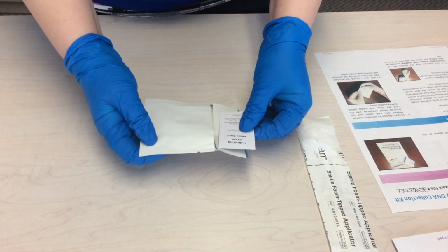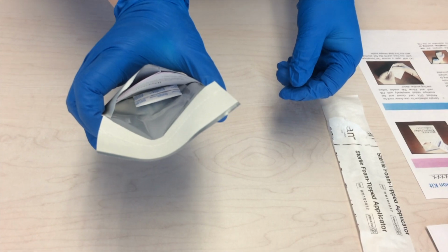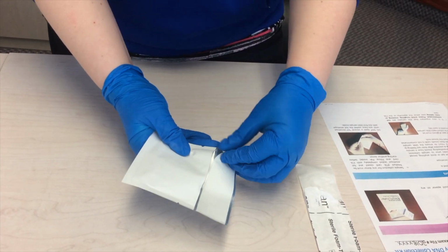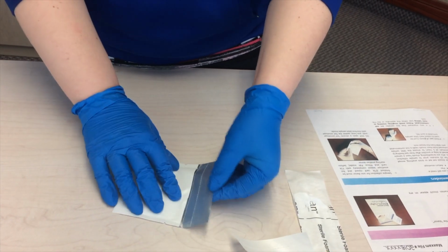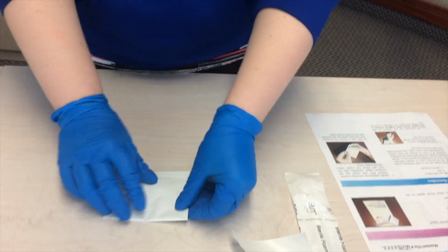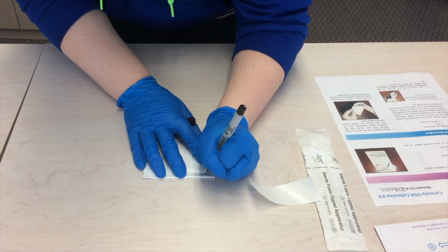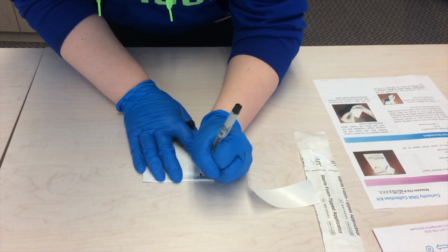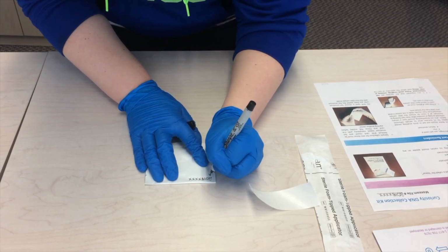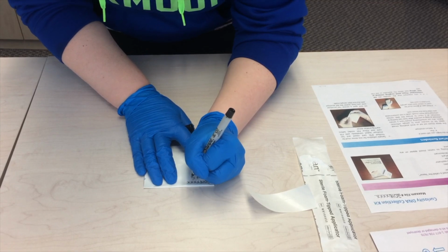Place the FTA sample card back inside the foil envelope. Note that the foil envelope now contains both the FTA sample card and the pillow pack. Remove the paper from the flap of the foil envelope and seal the sample inside. Label the outside of the foil pouch with the same information you labeled the FTA sample card with, which includes the file number, the donor status, and the ethnic origin for alleged fathers.